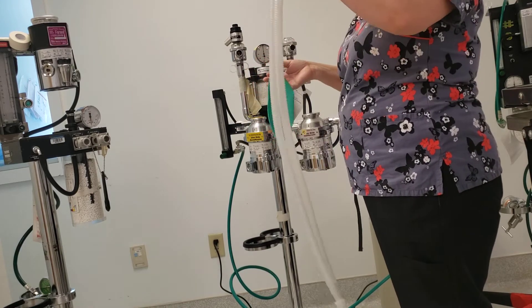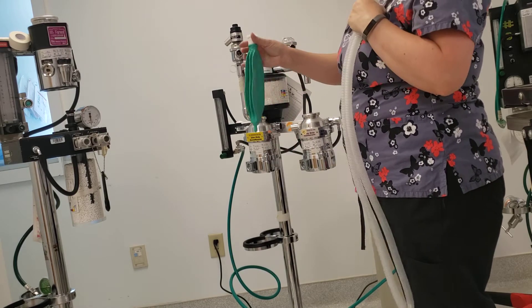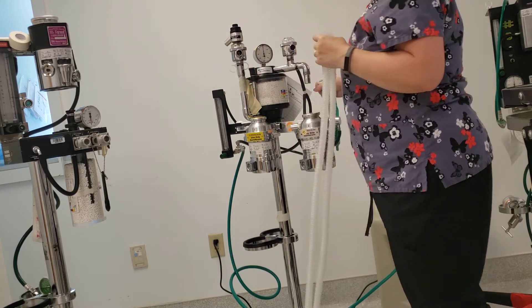Select the breathing tubes — in this case a rebreathing pediatric set — and a 2-liter bag. And we're going to attach that to our machine.